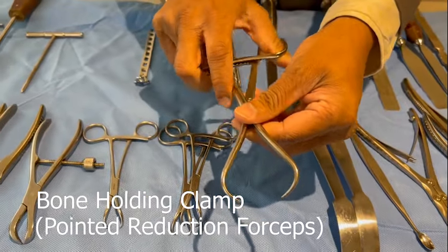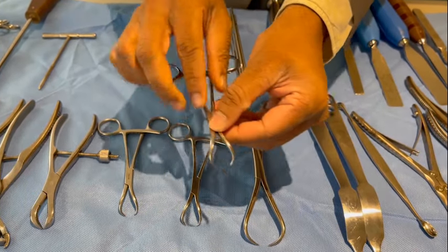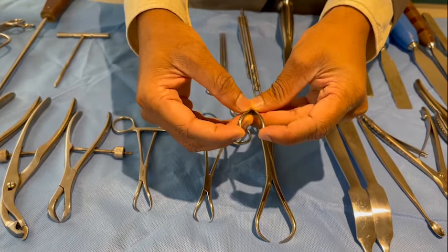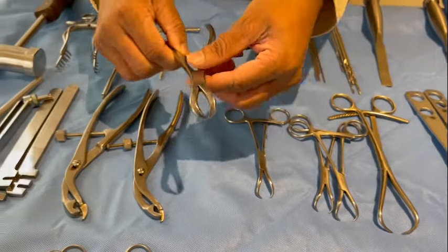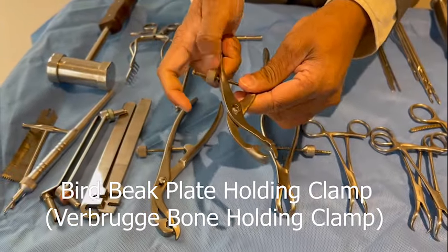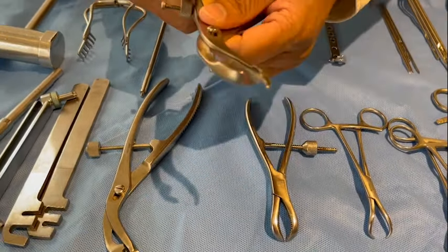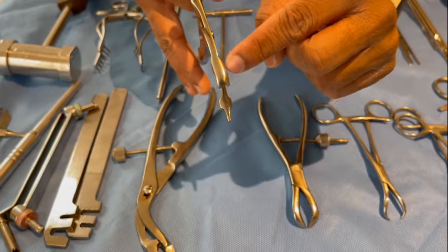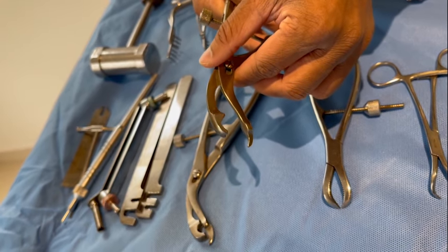This is a pointed bone holding clamp — a big one and a small one. The difference between a tower clip and a pointed bone holding clamp is that the points face towards each other, whereas the tower clips point slightly away from each other in order to pinch the towel. This is again a bone holding clamp. This is a bird-beak plate holding clamp — it has two surfaces. One surface allows the plate to be held against the bone. It is shaped in such a way that you can place the plate on the bone and hold the bone and the plate together after you have reduced the fracture, before you insert the screws.